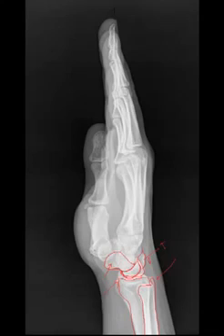We can also see a portion of the trapezium. We don't see much of the trapezoid, and the capitate sits directly on top of the lunate, and that's about as good as we're going to get. We don't see the pisiform very well. We don't see the hamate very well, and so you have to use your other radiographic projections to help you identify those structures.